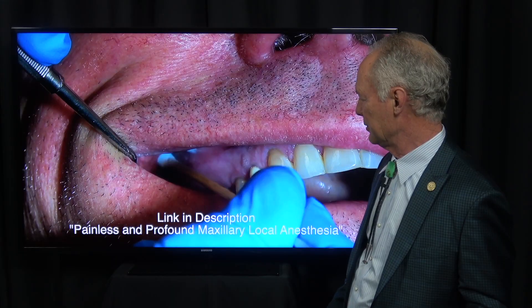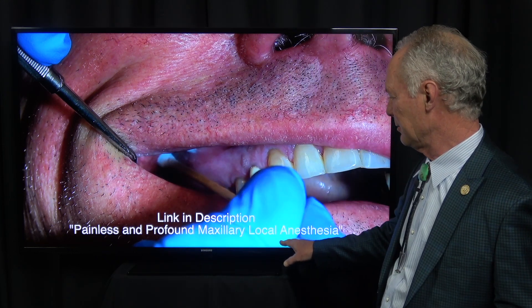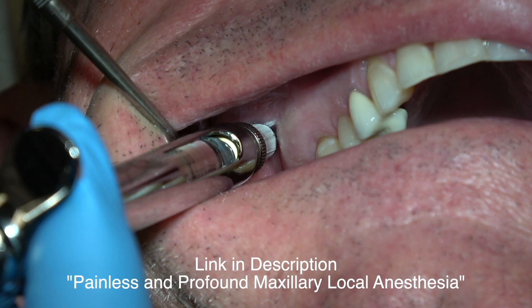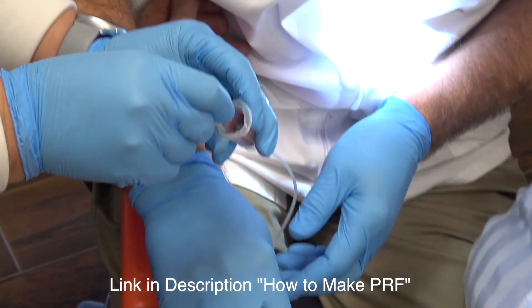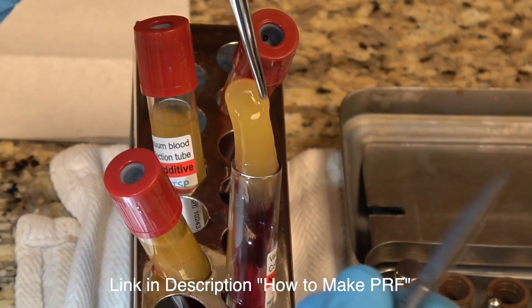First, we're going to administer topical anesthesia and anesthetize the area — you can link to painless and profound maxillary local anesthesia in the library of DentistryMasterClasses.com. This is an intraligamental injection, which is very important. Then we're going to draw the patient's blood and make platelet-rich fibrin, which is rich in growth factor, and we're going to use that in our graft procedure along with artificial bone.